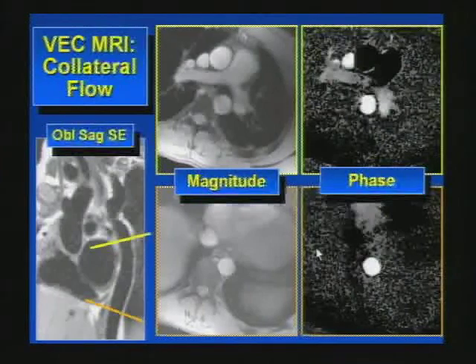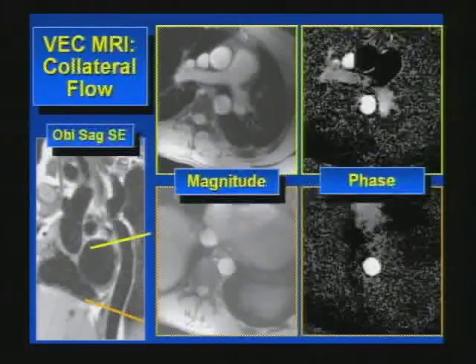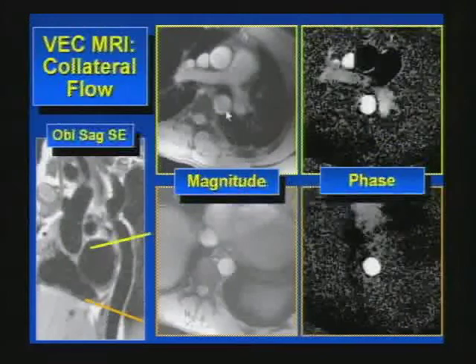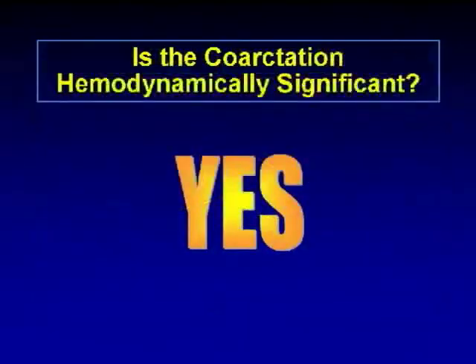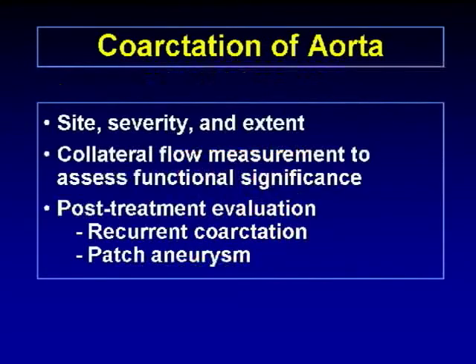Another important role of MR in coarctation is to measure collateral circulation, which determines if the coarctation is hemodynamically significant. We measure blood flow immediately distal to the stenosis and at the level of the diaphragm, using magnitude and phase images. A flow versus time curve in this patient shows much higher blood flow in the distal descending aorta compared to the proximal. The answer is yes — this coarctation is hemodynamically significant, because blood is coming through collaterals to the descending aorta, making diaphragmatic flow higher than proximal flow. MR is important for coarctation to determine site, severity, extent, and to measure collateral flow to assess functional significance.